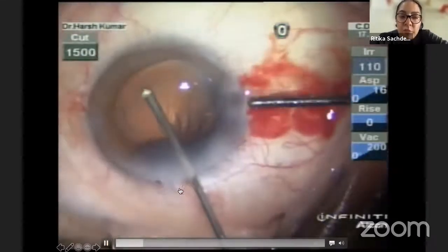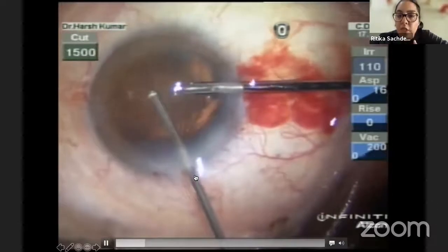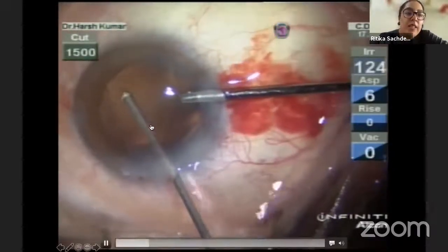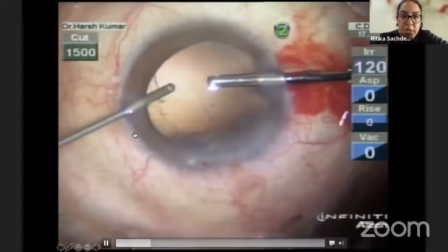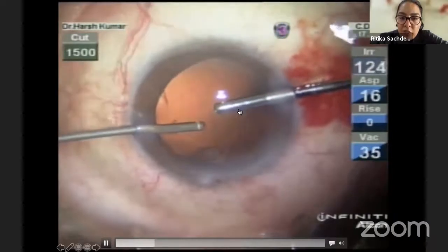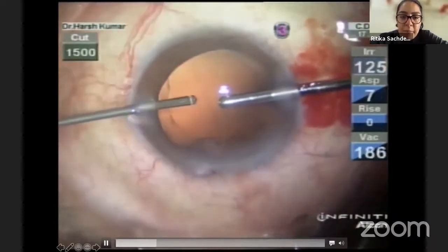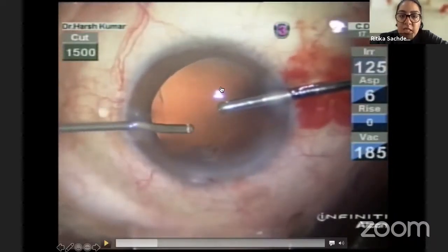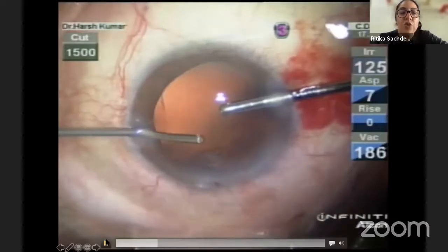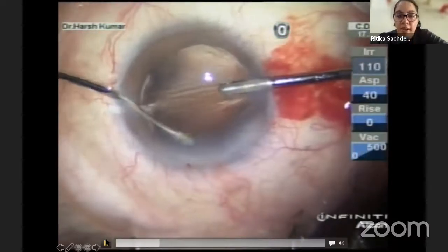When you have it through the main incision, you are going to depressurize the anterior chamber and more vitreous may surface. However, this is a good vitrectomy being done by expert hands. The bimanual irrigation piece is being used to maintain the anterior chamber. You see, this is a different direction. And you see the cutter pointing upwards will go beyond the PC rupture 1 to 2 mm. And so you're pulling the vitreous back.